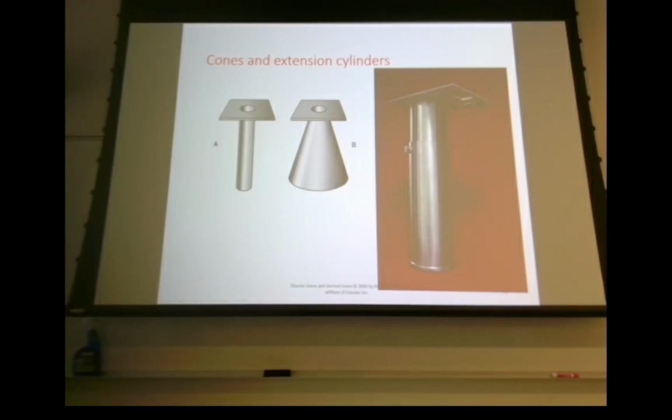And if you look at figure 22.13, we used to use them on sinuses quite a bit. So this thing, you could strap to the front of your collimator housing, and then you could extend it all the way out to the skin line. So it's very effective in removing any kind of divergent central ray, so that it's just focused on what was dead square in the middle of that cone.